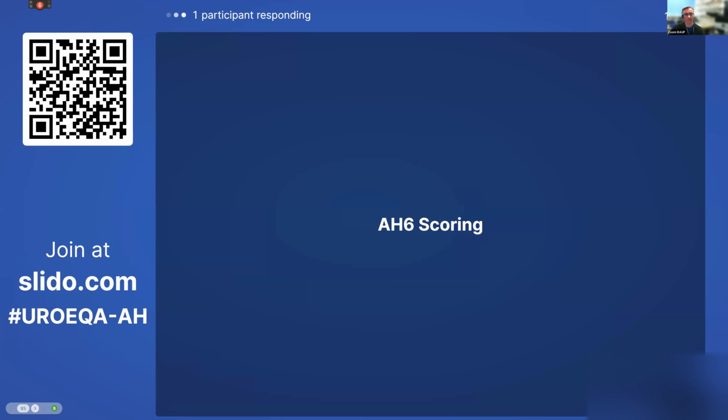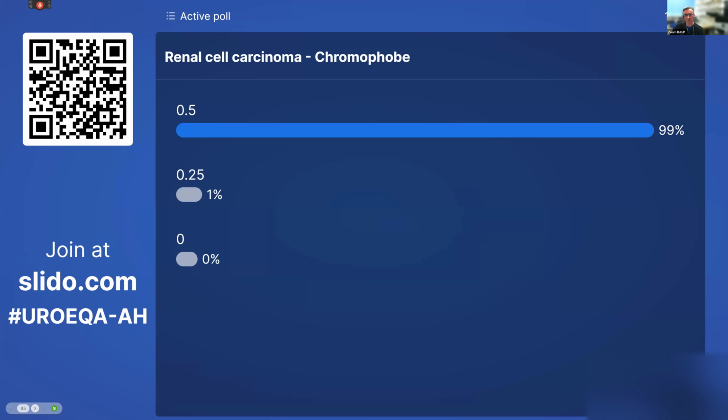Okay, so renal cell carcinoma chromophobe scores 0.5. Oncocytic renal neoplasm scores 0. And oncocytoma is 0 as well.